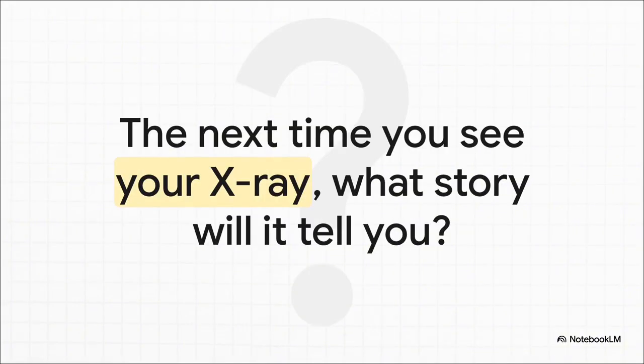So, there you have it. You are no longer just sitting there passively nodding along. You now have the basic tools to be an active part of the conversation about your own health. So the next time your dentist puts up that image, you're going to be able to see the story it's telling. The real question is, what will you discover?